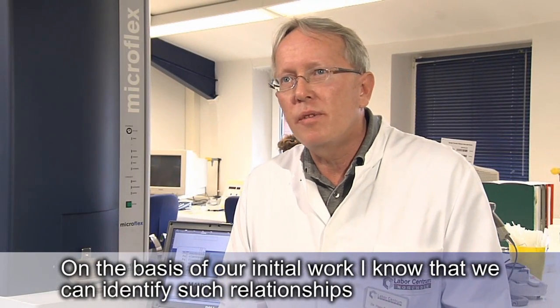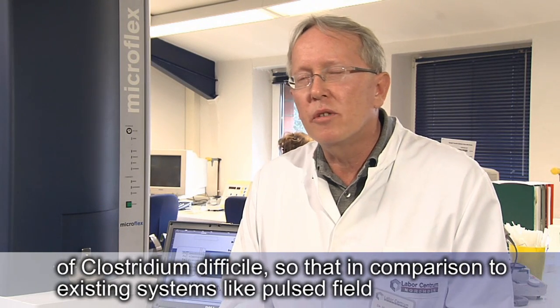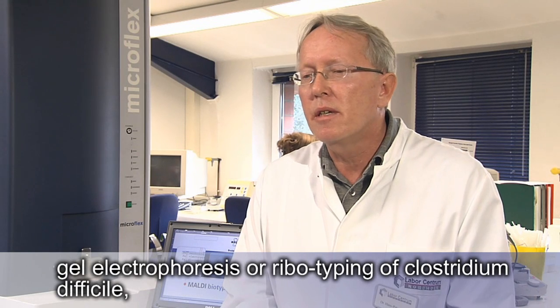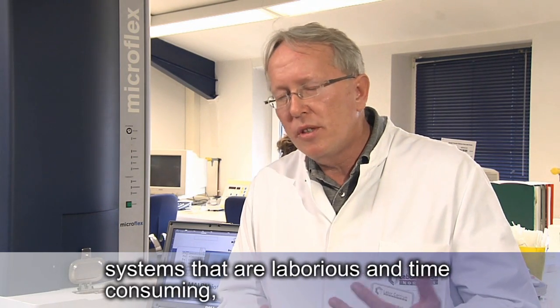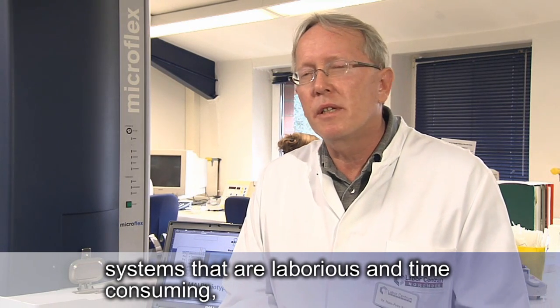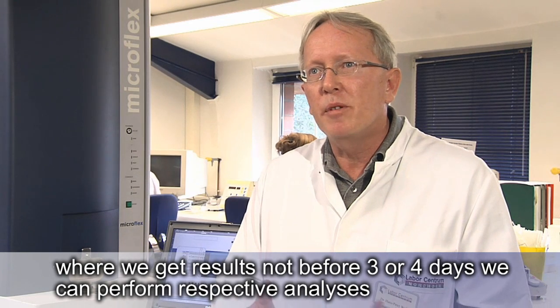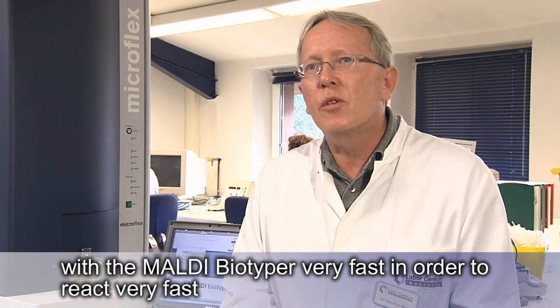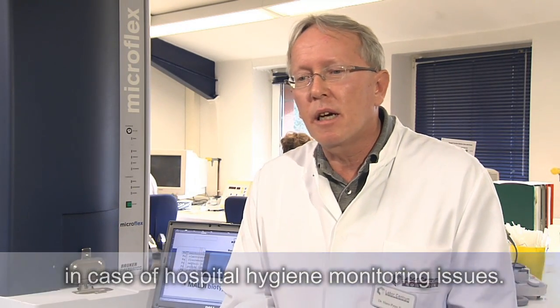On the basis of our initial work, I know that we can identify such relationships of Clostridium difficile, so that in comparison to existing systems like pulsed field gel electrophoresis or ribotyping of Clostridium difficile, systems that are laborious and time-consuming, where we get results not before 3 or 4 days, we can perform respective analyses with the Maldi Biotyper very fast, in order to react very fast in case of hospital hygiene monitoring issues.